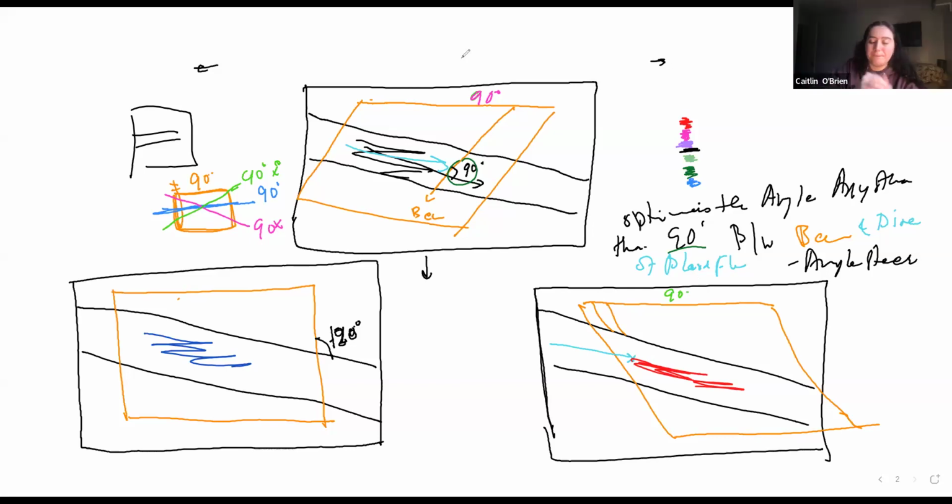Okay. So point number one, or you can say step number one. First and foremost, make sure that your color Doppler mode is on if you want to record a color Doppler. Once that is on, you will see your box, which marks or displays the direction in which the beam is being steered.